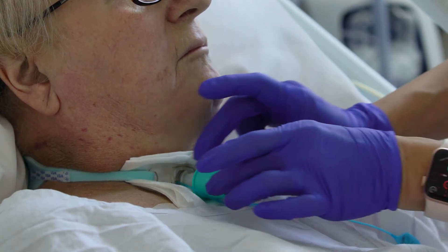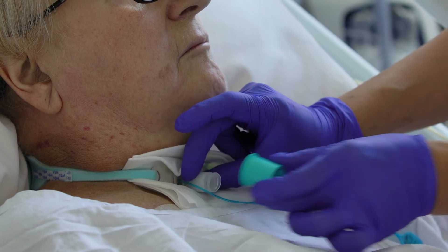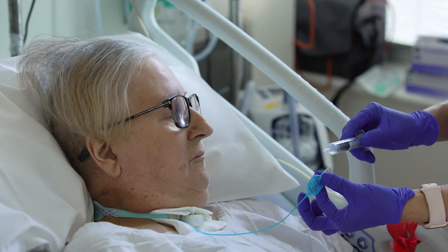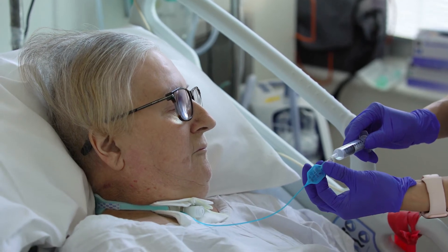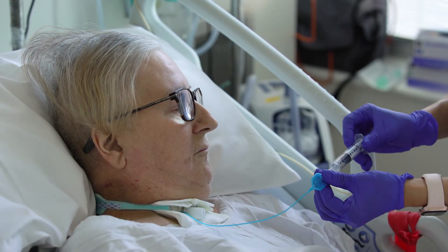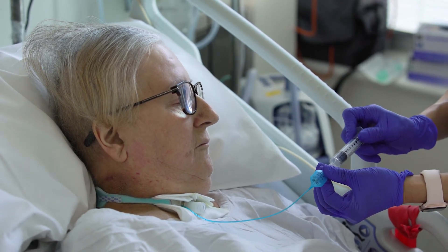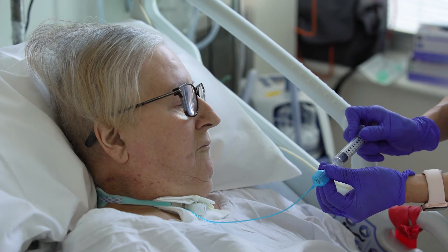If the patient is using a Passy Muir valve, this must be removed prior to inflating the cuff. The cuff on most tracheostomy tubes is inflated by injecting air into the pilot cuff line. To re-inflate the cuff, use a 10ml syringe to introduce air slowly to avoid discomfort.